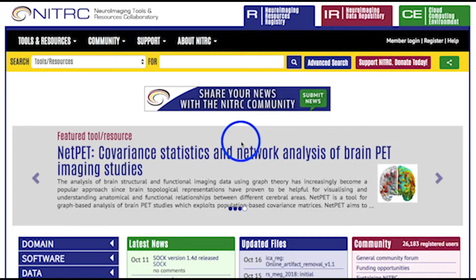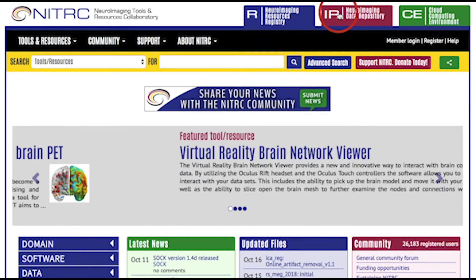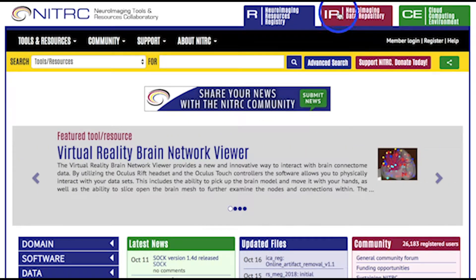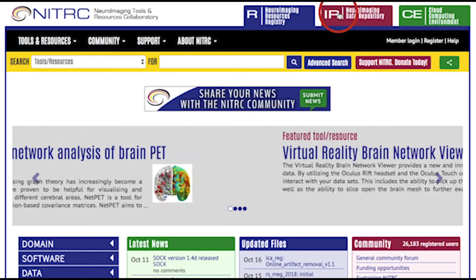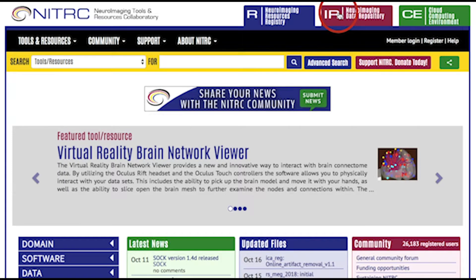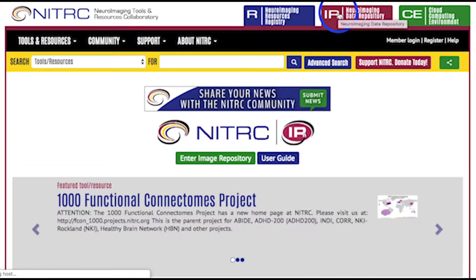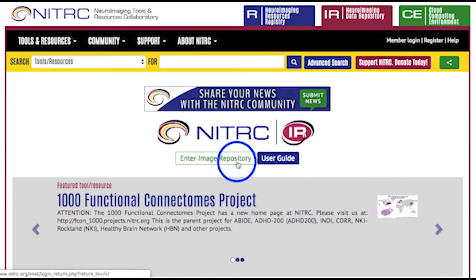As a user, you can search for and freely download publicly available datasets. You may access the Image Repository with the tab in the site header designated for Nitric IR. On this page, you can see the latest Nitric IR-related information and enter the Image Repository.